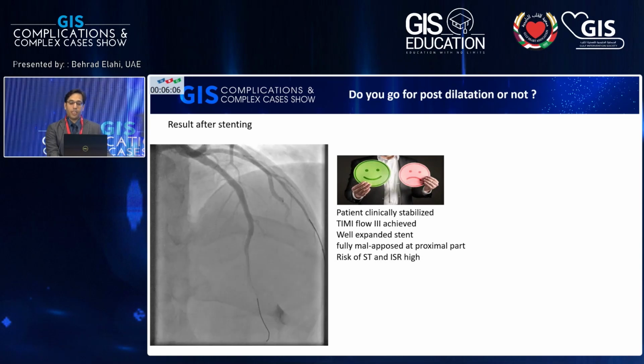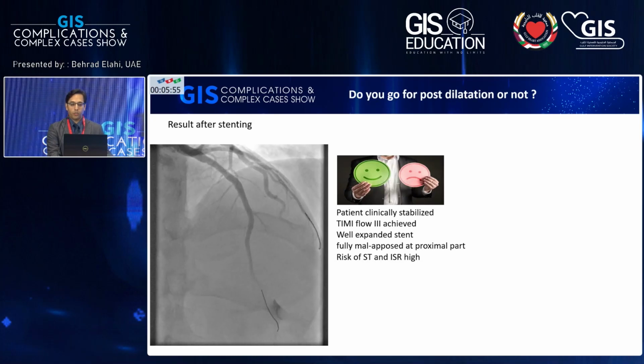The question was that, should I go for the post-dilatation at the same setting, or should I put the patient for 2-3 days on the anticoagulation, and after that bring the patient back to the cath lab and go for the post-dilatation?